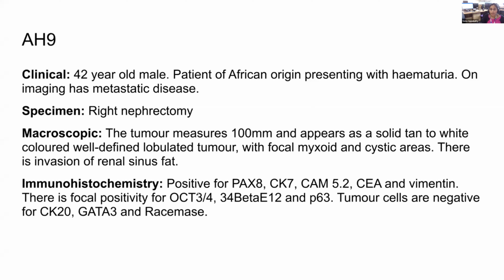Immunohistochemistry, I'm sure they were trying to help us. A positivity for PAX8 would mean it's kidney, thyroid, or Mullerian, but this is a man, so we're thinking of probably primary here. CK7 positive, I'm thinking it's not clear cell. Vimentin positive, it's not chromophobe. I was just thinking if it is justifying the submitter a bit, that there were some helpful clues in the immunohistochemistry provided.